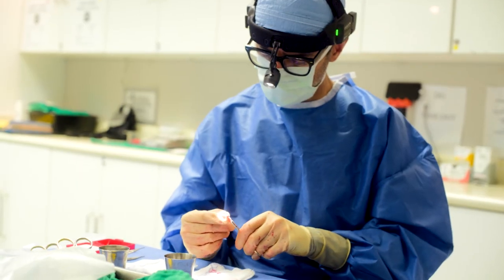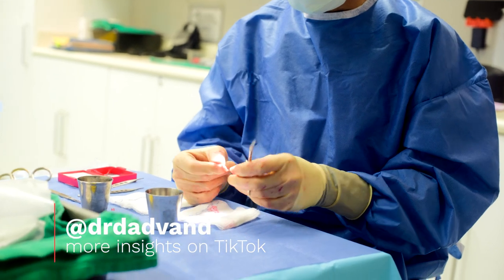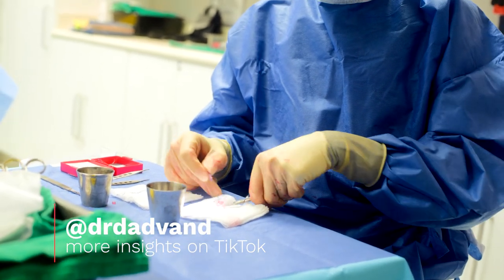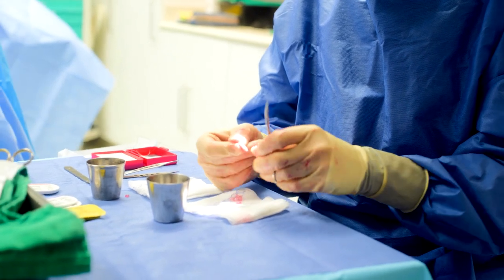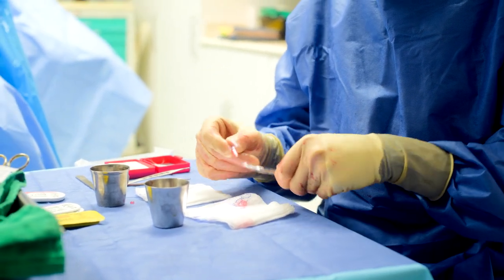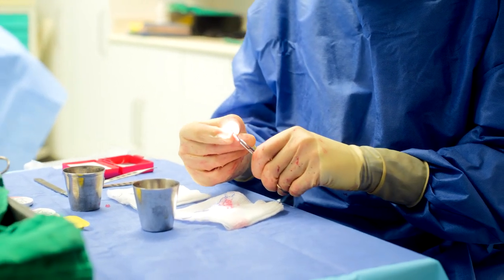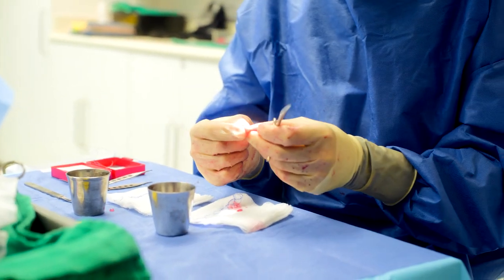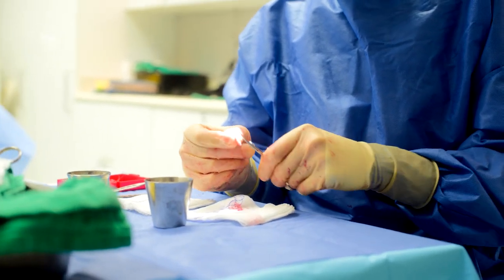I'm just thinning up these areolas to get them ready to be put on as an areola graft. Then I'm going to take the nipple and make it much smaller to be used as a free nipple graft. It's really important to know how thin to leave these — not too thin, not too thick. This is where experience really comes into play.